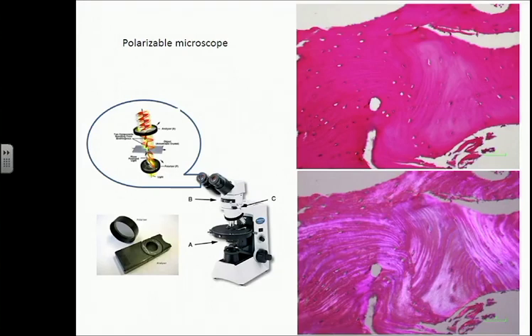We can use regular light microscopy as pathologists to identify the difference, and really the difference is that I don't see this nice lamellae. The other thing is that in woven bone, you feel there are more osteocytes within the matrix compared to lamellar bone, but this is very subjective. So we need a more objective measure to differentiate between lamellar and woven bone.